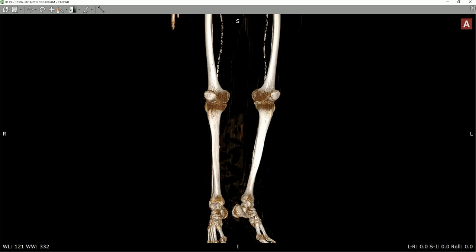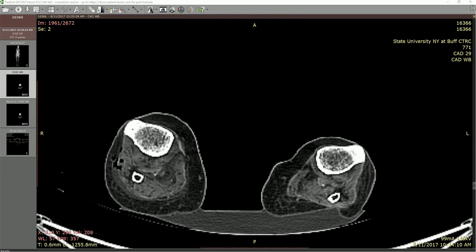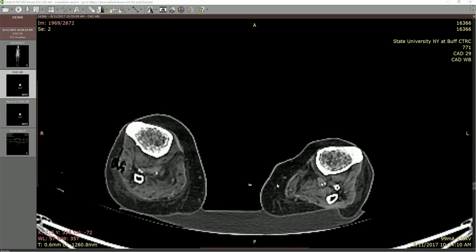Moving down the leg, we can see the tibia — notice the density of the bone at the front, that ridge of bone where we see the anchoring of the anterior portion of the crural fascia. So this would be the anterior compartment here with tibialis anterior, extensor digitorum longus, and extensor hallucis longus. Remember the fibula — this would be the lateral compartment, and then the much larger posterior compartment. Again, with cutaneous fat tissue on the outside. You can see a distinction between the deep and superficial aspects of the posterior compartment as well.